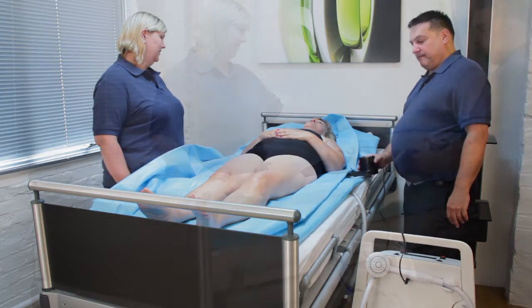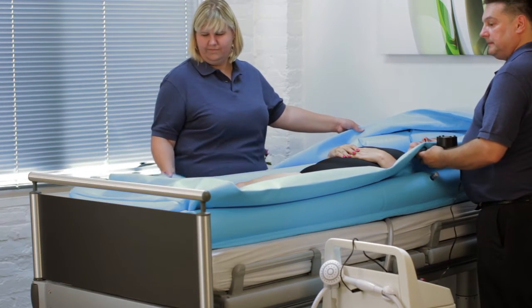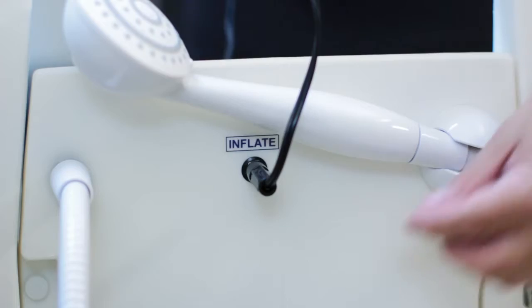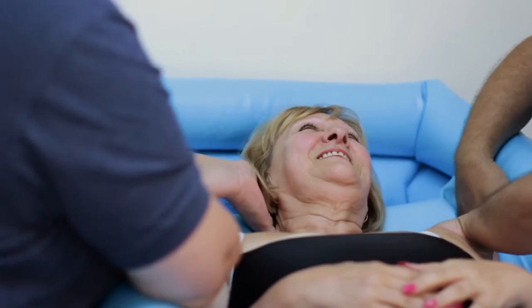Turn on the inflator's white switch and inflate the lower section. Once inflated, disconnect and insert the inflator into the second valve and inflate the upper section. Inflate the pillow, then disconnect the inflator completely. Adjust the profile of the bed for the comfort of your patient.